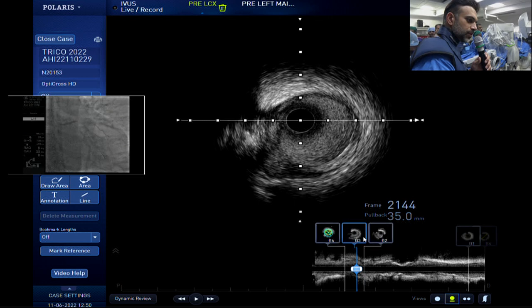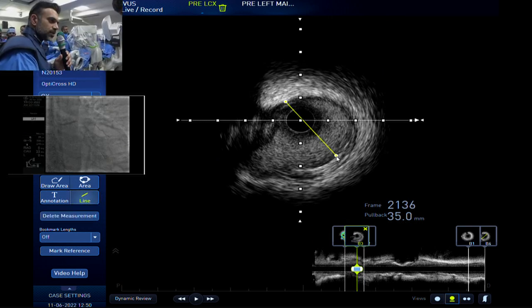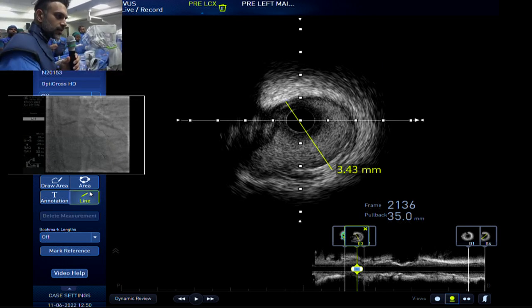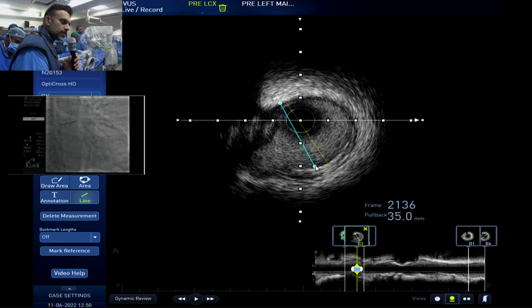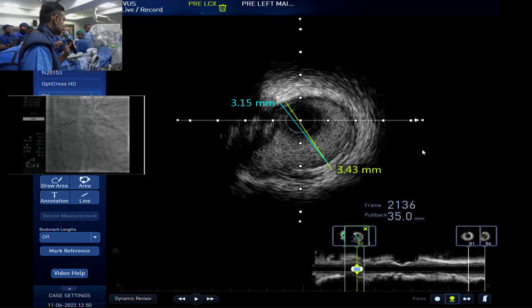So that was at B3. So let's take this now. Your proximal landing zone is going to be roughly here, 3.43, roughly here to the lumen, right? 3.15, right? So a 3.0 is going to be a plenty NC balloon for that.